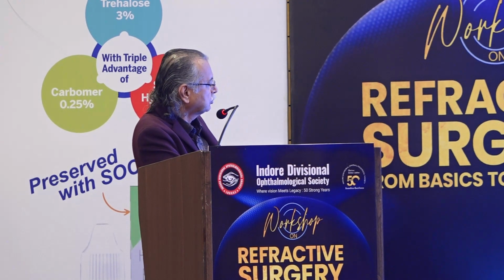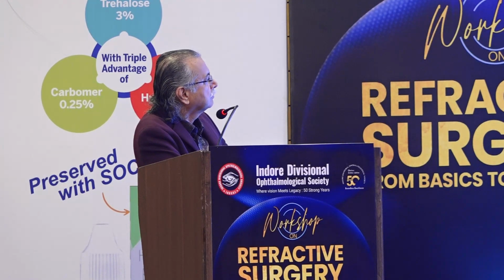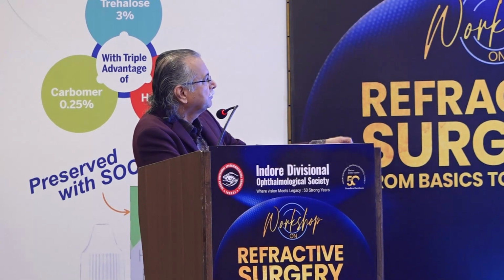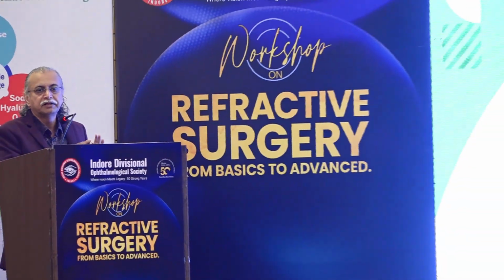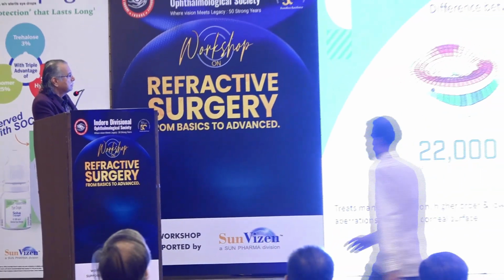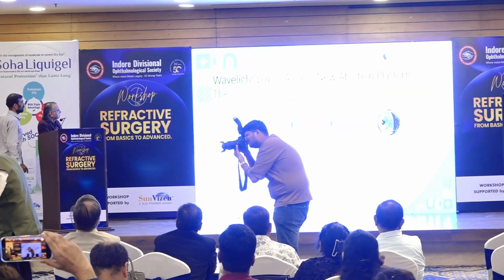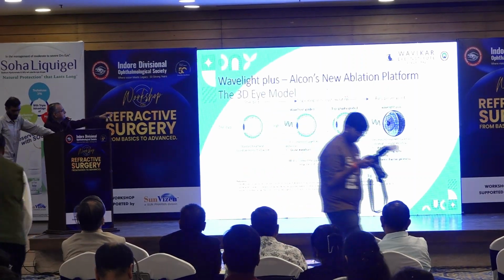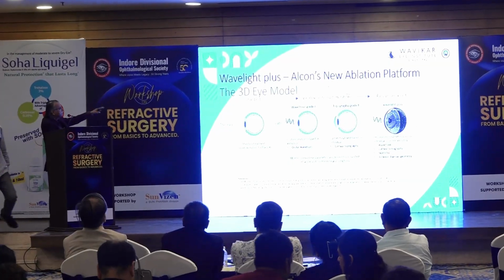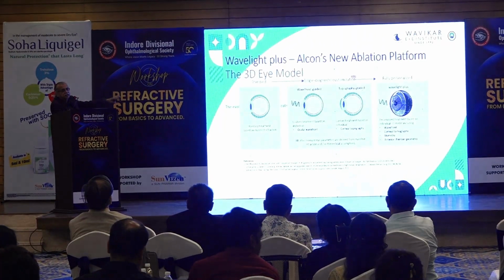So in Contura, as she has already explained, we are studying 22,000 points on the corneal surface only, whereas in aberrometry, you are just measuring the aberrations of the entire eye. But what Wavelight Plus is doing is this plus this and something else. Wavefront guided, that means aberrometry guided treatment, and topography guided treatment, that means Contura, and the geometry of the anterior chamber, axial length, etc.